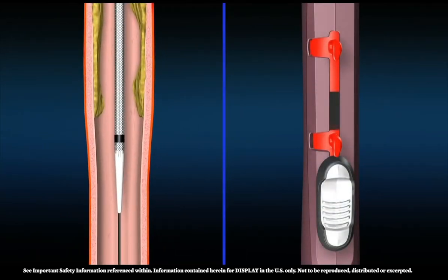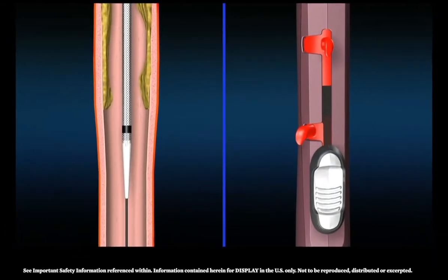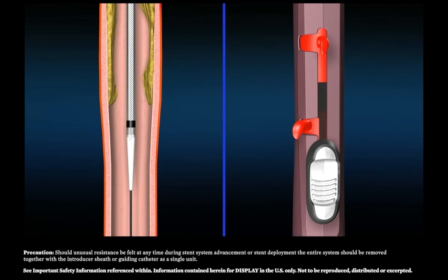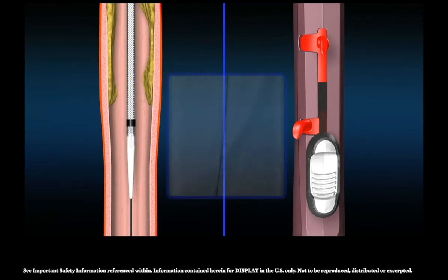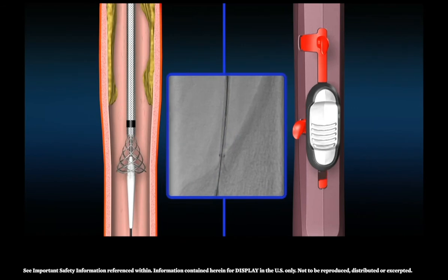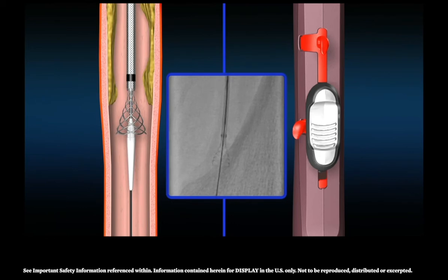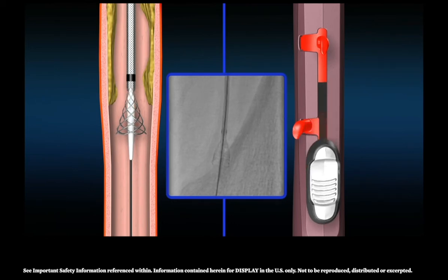To initiate deployment, rotate the system lock to the unlocked position. Do not unlock the deployment lock. Slowly advance the thumb slide. Increase magnification to better visualize stent deployment. Maintain increased magnification during the entire stent deployment procedure.